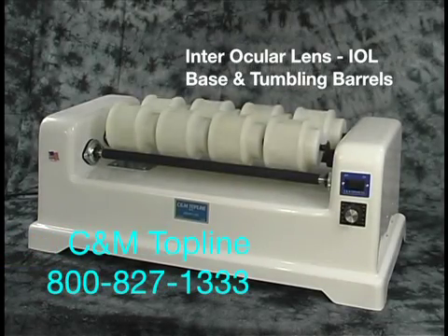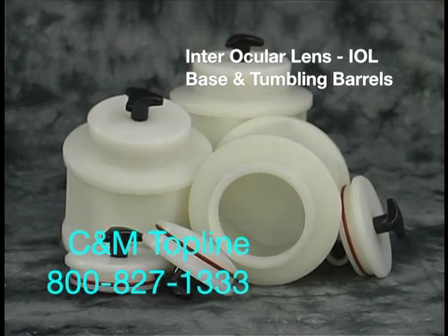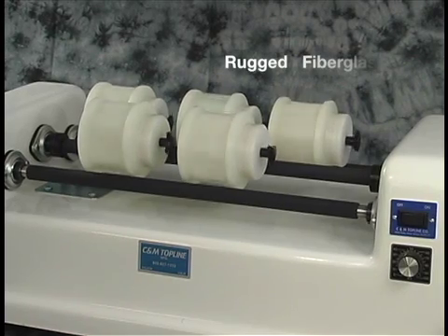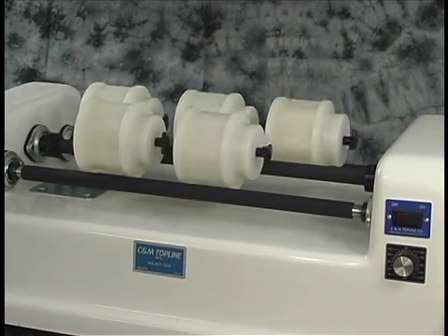We are going to show you the features of the CNM Topline Interocular Lens or IOL base in tumbling barrels. This machine is constructed from rugged fiberglass with a high gloss white finish.